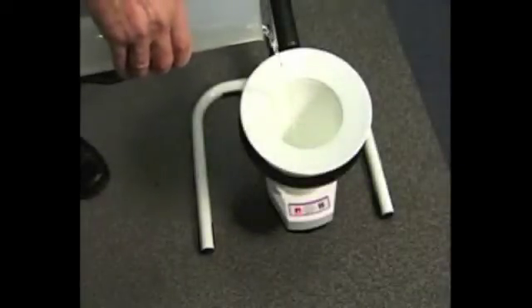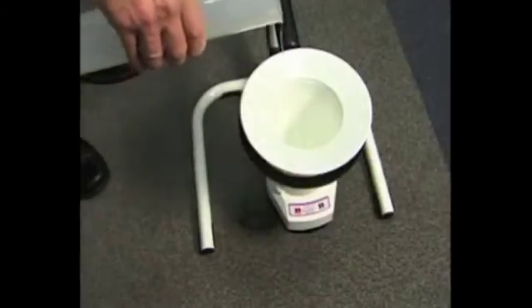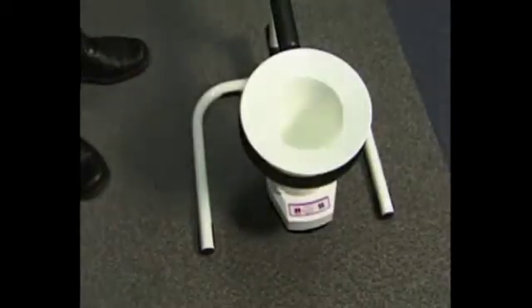The wireless weight cell flowmeter is also ideal for patients to use at home. It runs on battery and can store up to 100 uroflows for later uploading.